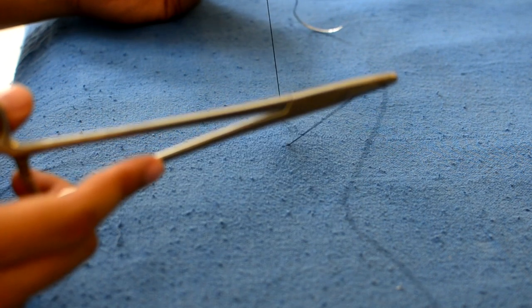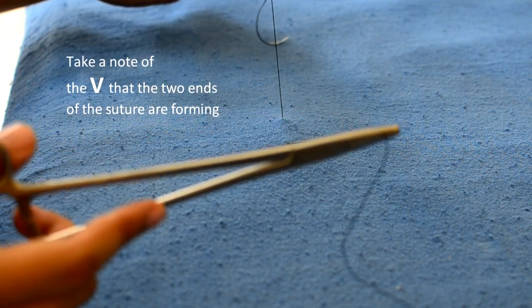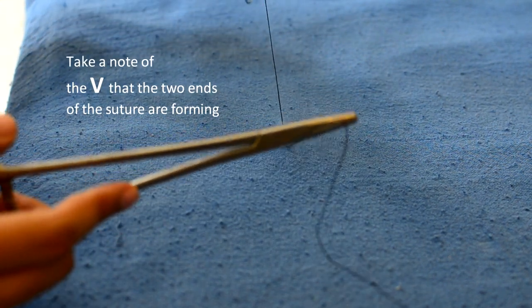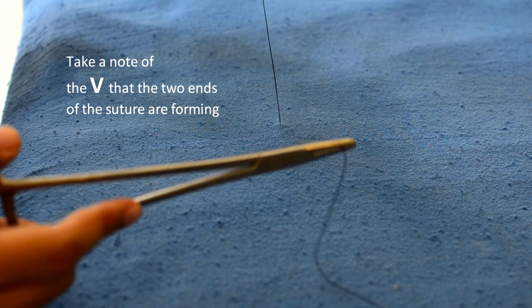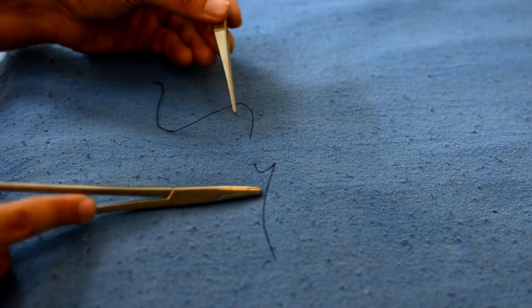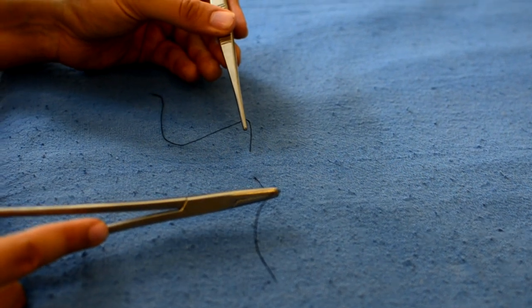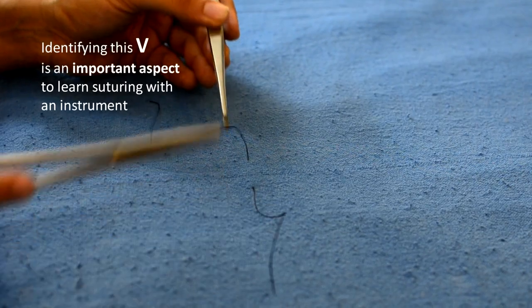Now let's take a look at the V that the two ends are forming. Identifying this V is an important aspect to learn suturing with an instrument.